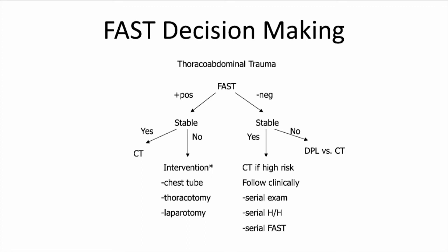And then we didn't talk too much about this, but in patients with penetrating abdominal trauma, free fluid indicates likely intestinal or other injury that likely is going to warrant exploratory laparotomy. That may help some of that decision making, whereas in the patient with penetrating abdominal trauma and no intra-abdominal fluid, then you may go down the pathway of further imaging and clinical observation in some settings.